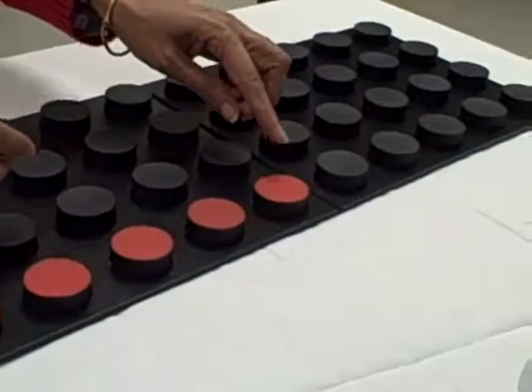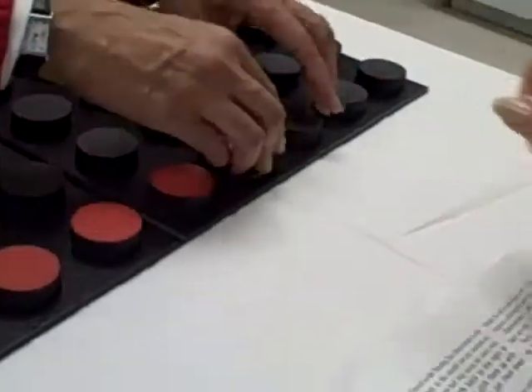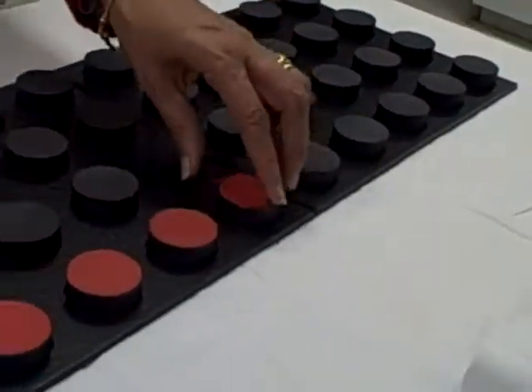After she would get all the way across, then she would go back in the other direction. So this way, keep going that direction. And the final score, you can stop. The final score is the time it takes to turn over all the blocks.